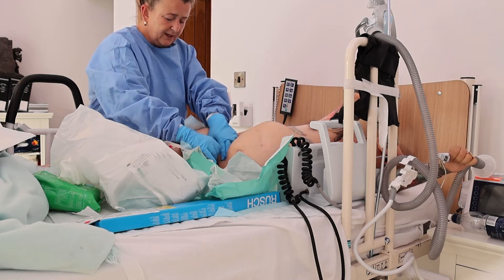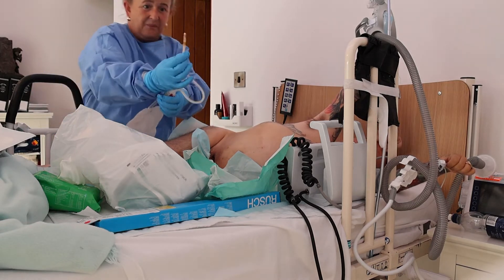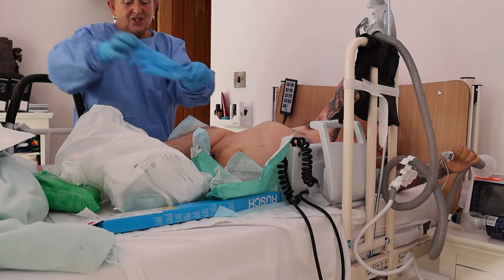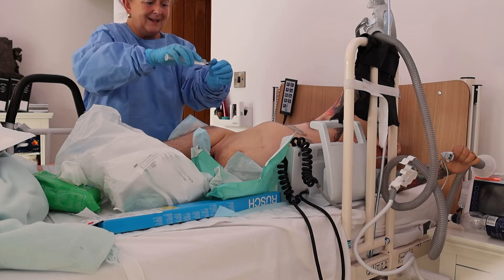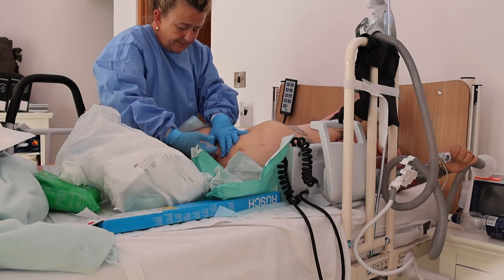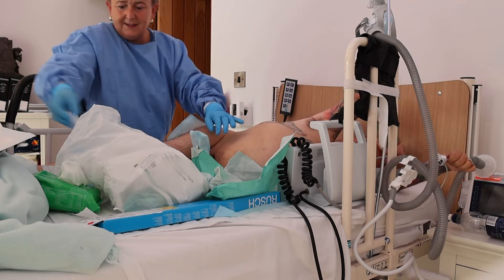I ask him to take one nice breath, then gently pull it out. Oh — I knew I could smell infection. Look at the state of that — it's infected. I could smell it on him this morning and I told him straight. I'll get that sterilized dirty glove off quickly. Because I've still got a clean hand, I'll use that to take the cap off.